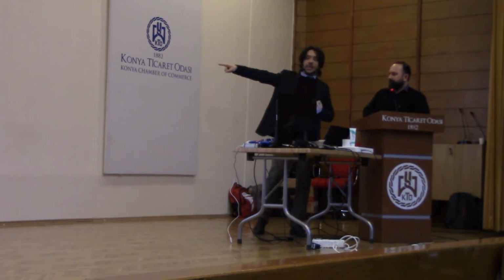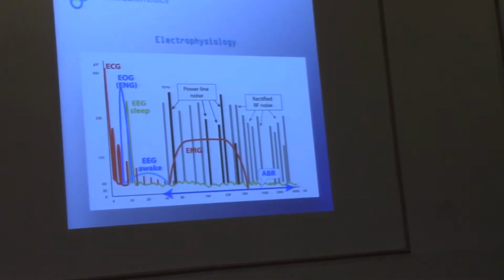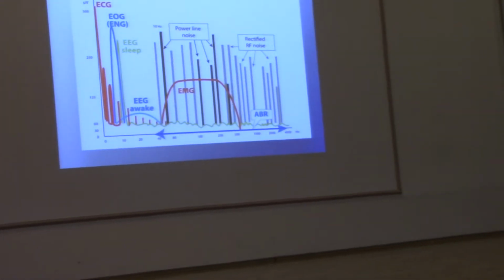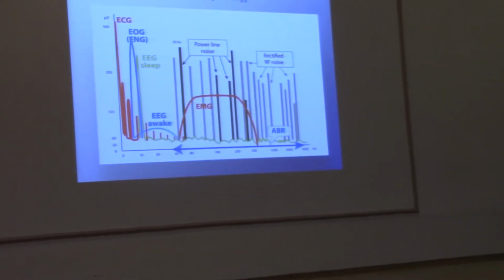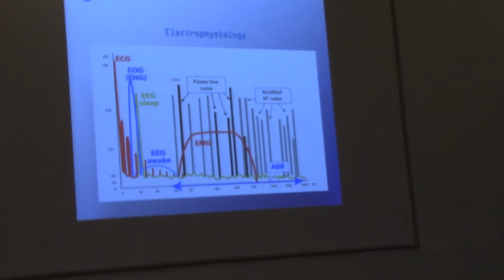Fifth peak, you see on the horizontal axis, you have 250, 300 hertz. 300 hertz is around the spectrum of the fifth peak. So if your electromyogenic interference covers, or whatever covers, that kind of area, your fifth peak will be a ghost.